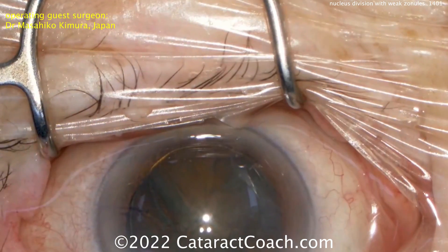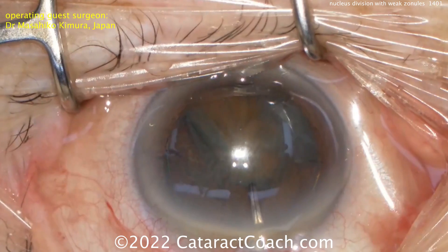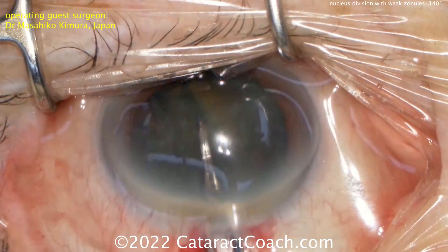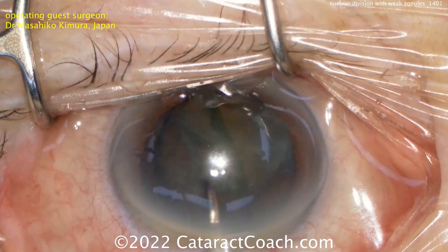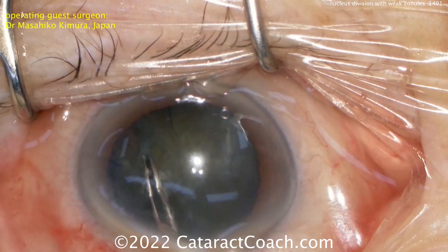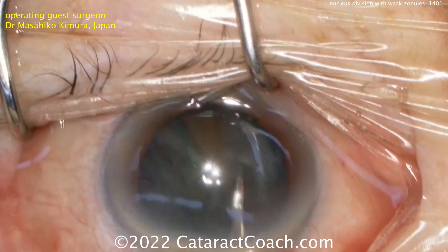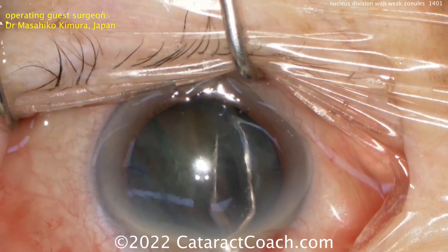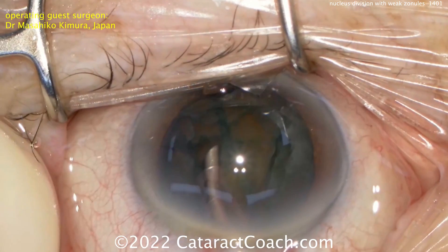There's the delineation — a little bit of a golden ring there. And then more viscoelastic, there's the pre-chopper going inside and splitting the nucleus. You have two halves now. And then each half can be split again into little strips — you can create four strips of nucleus. Again, no rotation is required, and these can be removed with the phaco probe.